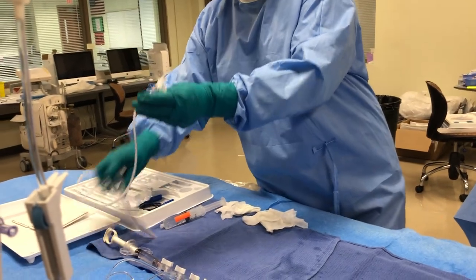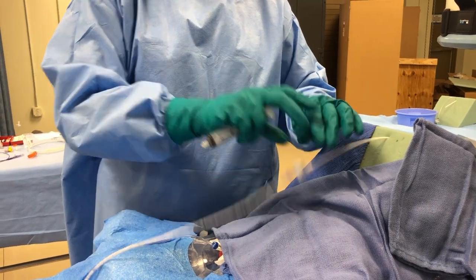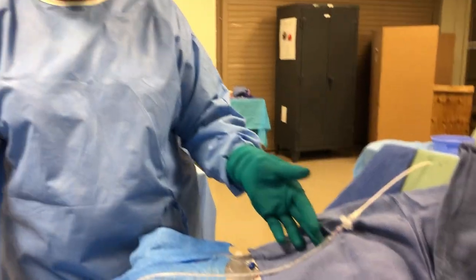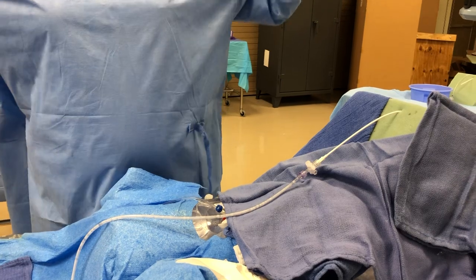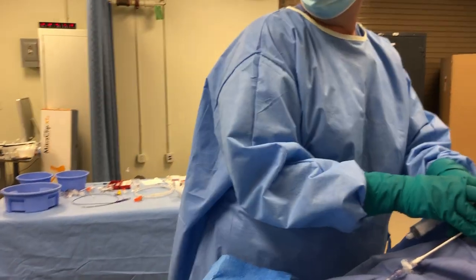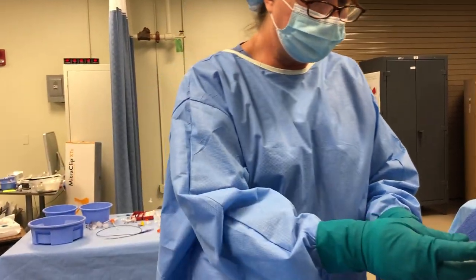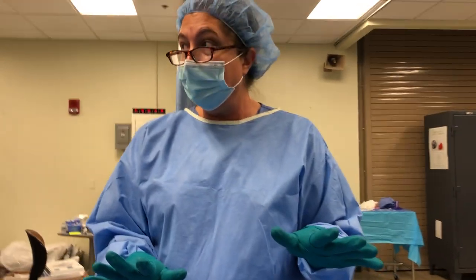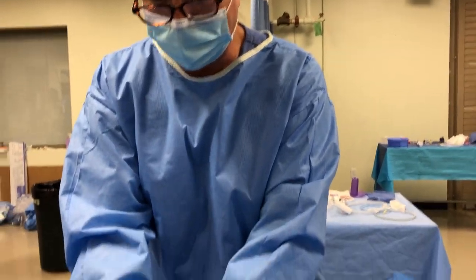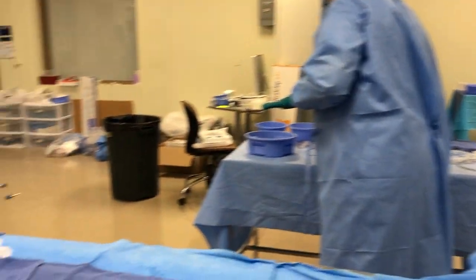I'll try to reach up and wipe, then the doctor's ready for the catheter — load the catheter on and give tension on the wire. It can be done one-handed but it's not as easy, so I'll have you hold the wire so I can concentrate on getting the catheter in. Wire comes out. I need my 20cc syringe and my bag ready to connect. Also, while all this is going on, we want to try to get these sharps out of here so we don't get stuck.